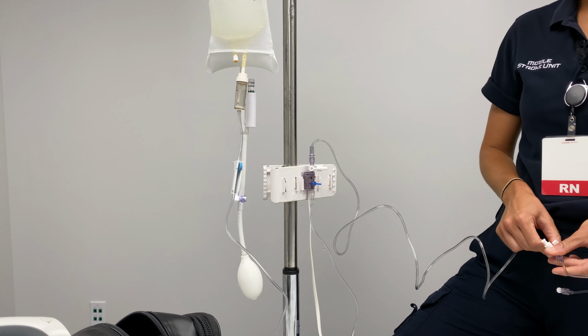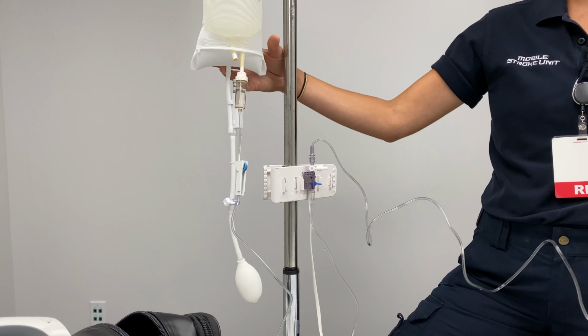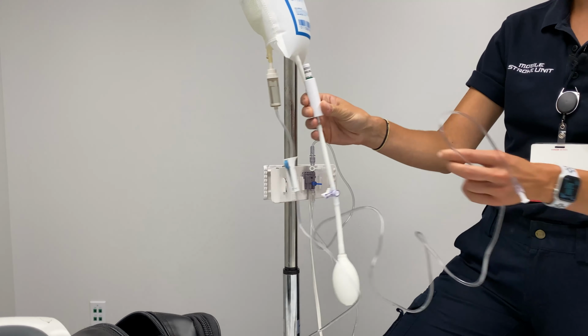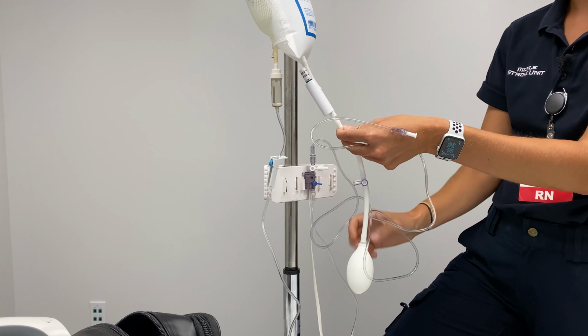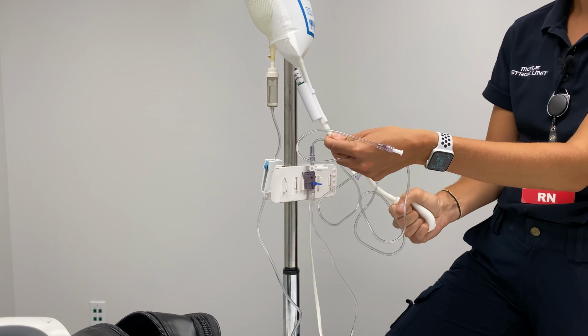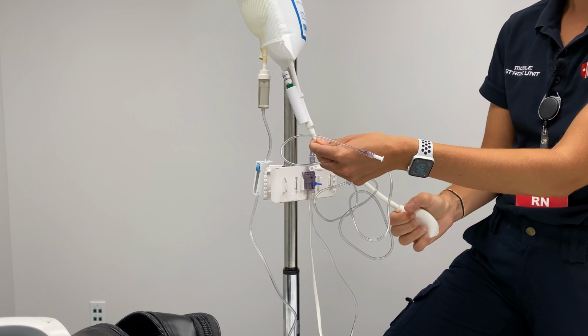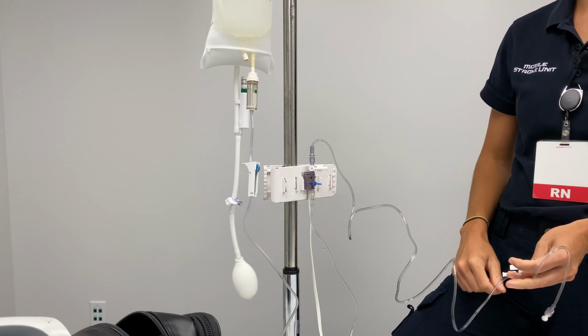So one important step after you have your A-line all set up, right before you're going to zero it, is you're going to make sure that you still have an adequate amount of pressure in your bag. So I can pump it up a little bit more so that it's further in the green, and then you're set to zero it.